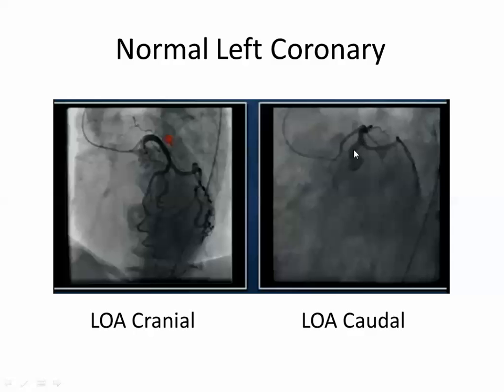As you see, from this view I can see the left main and assess it well. And I can see the bifurcation into the LAD and LCX. This is one of the best views used for engagement of the wires and assessment of left main disease and ostial and proximal LAD and LCX. Because as we said before, the caudal view will assess which segments, proximal or distal?